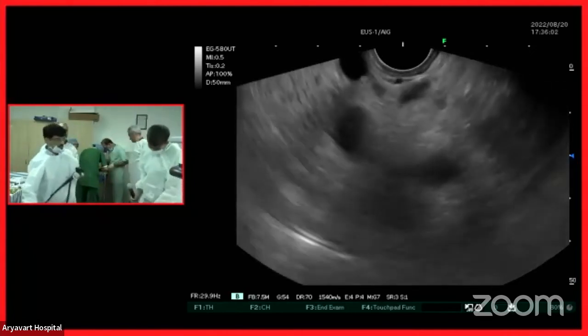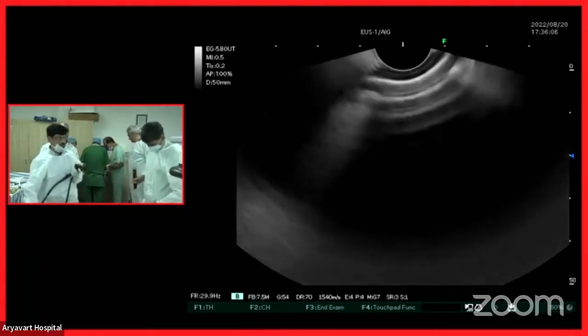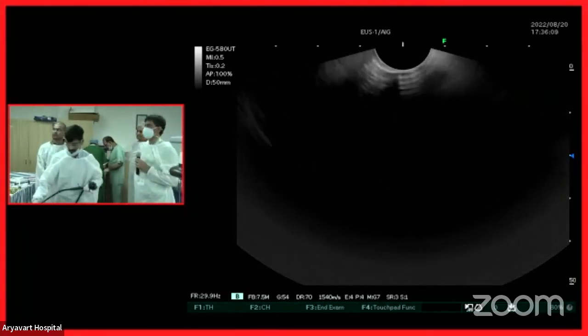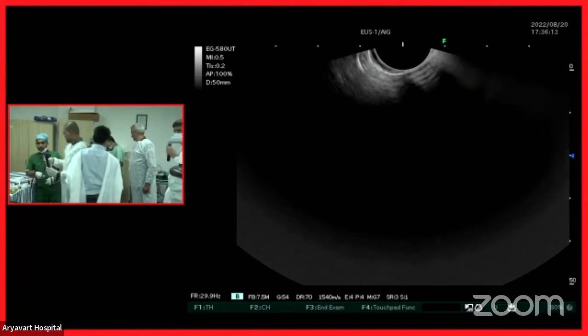And I think it's not the end of the world if we can't get an FNA for a patient. I think we should always look at other means of getting a diagnosis. Thank you for the opportunity. Thank you for the very nice demonstration. Any questions to Dr. Sharat?